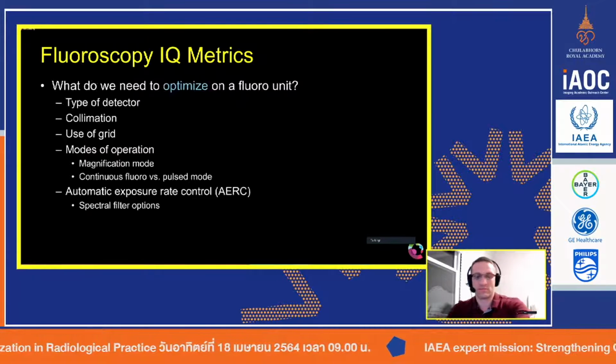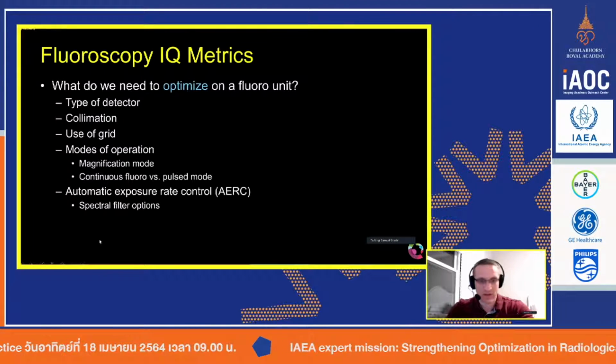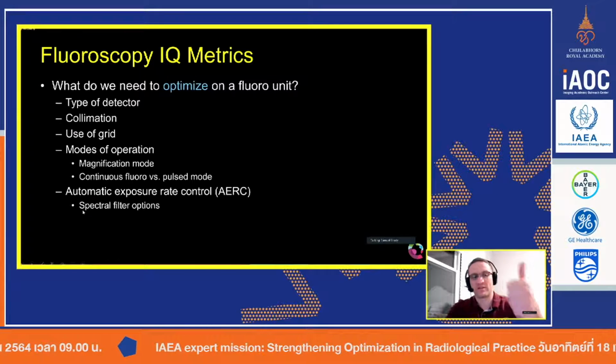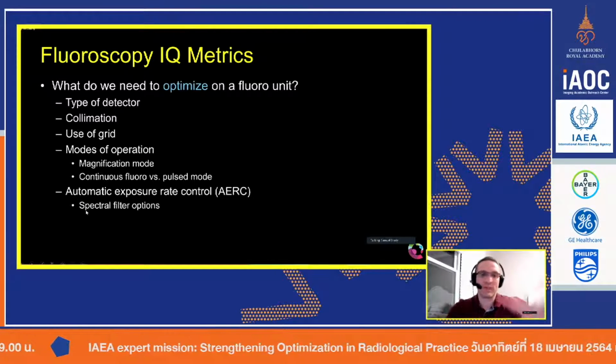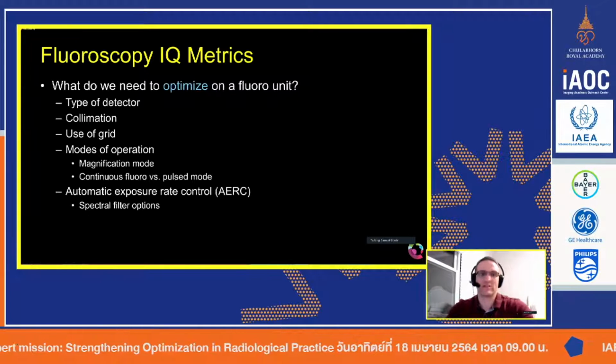Whoop, didn't mean to flip over too quick. The amount of filtration, and I meant to write kV and mA, so that's my apology. I said it out loud though. So the AERC will affect the filtration, the kV and mA. So this right here is kind of the list of things we're going to go over today.